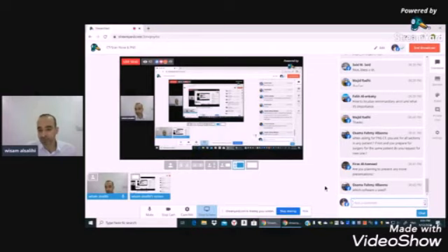Dr. Osama Fahmi: I use DICOM Viewer. It's free on Google. DICOM Viewer.